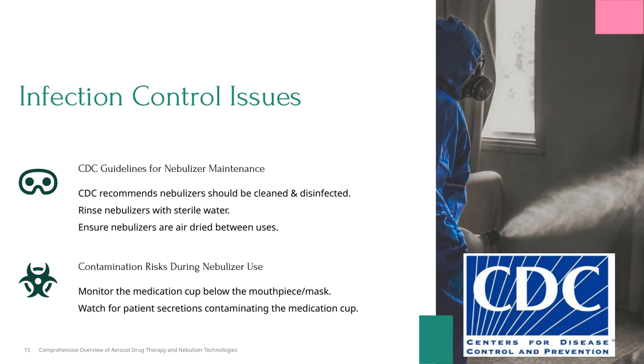This ties into infection control issues, which are a critical part of safe nebulizer therapy. Proper cleaning and drying help prevent the spread of infections, protecting both the patient and healthcare staff. By following these guidelines, we help maintain a safe environment and ensure effective treatment. Remember, maintaining these practices is key to minimizing contamination risks and promoting overall respiratory health.